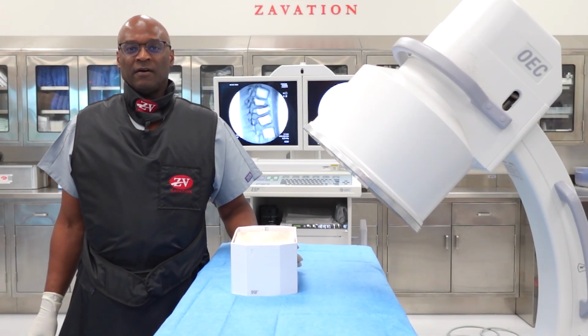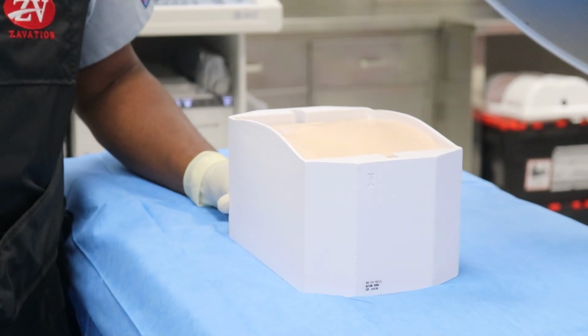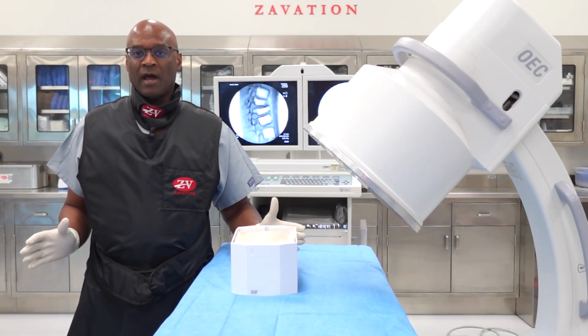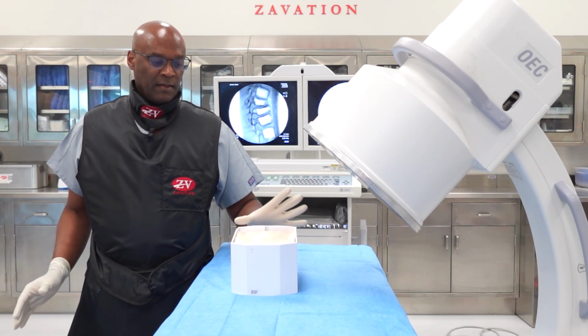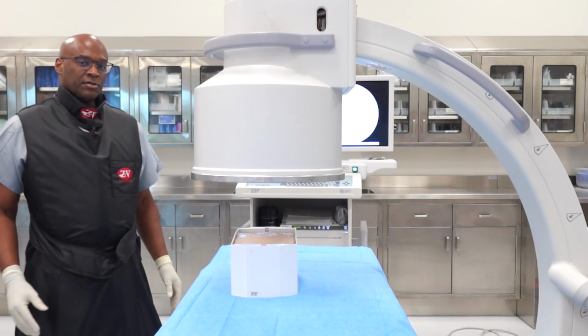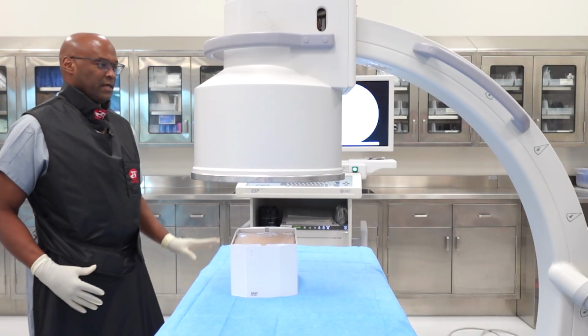We are using the Biomers training model to reproduce a vertebral compression fracture. The important thing is to make sure that your C-arm is set up for adequate AP and lateral, and that you have the model in a prone position. So we're starting with the AP and the lateral views of the spine. This is the AP view.